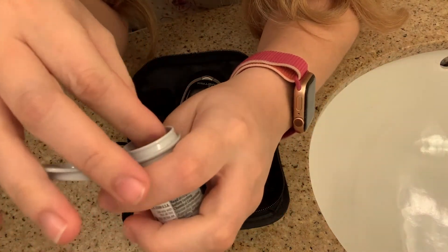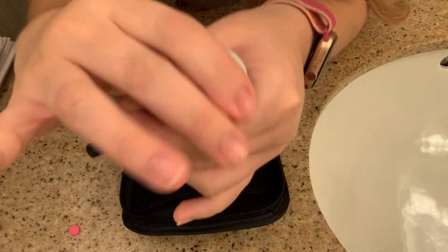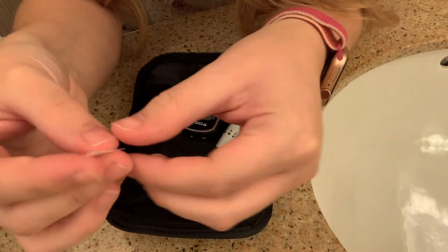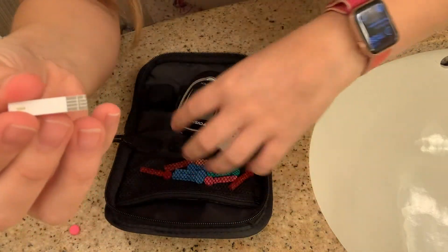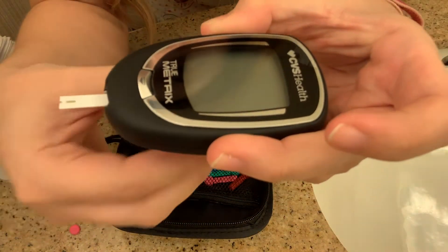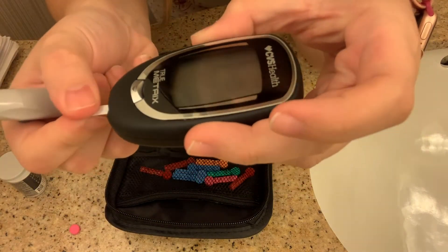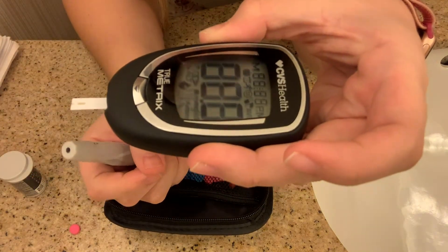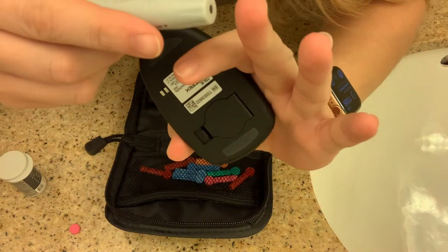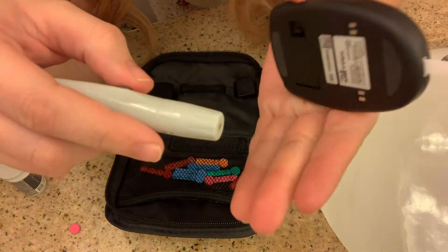Next, open your testing strips, get one out, and immediately close the container back up. The side that goes into the monitor is the gray one that looks kind of like a chip — that's the part you insert into the monitor. It's important to make sure the testing strip is all the way in, and you'll know because the monitor will instantly light up and start working.